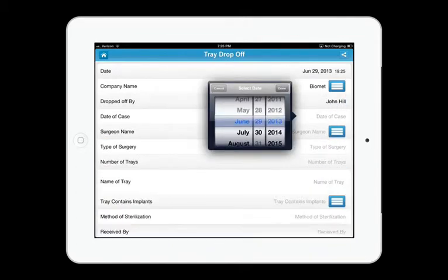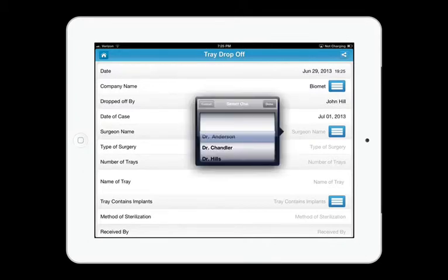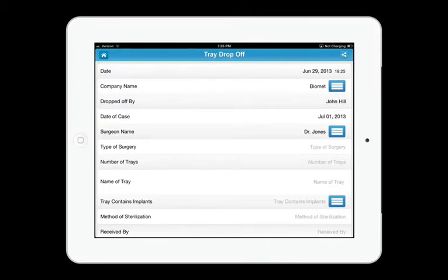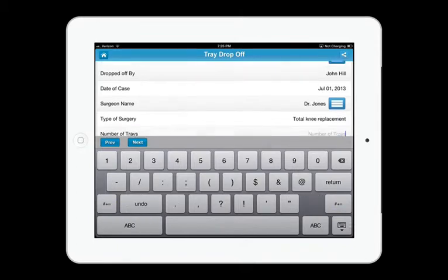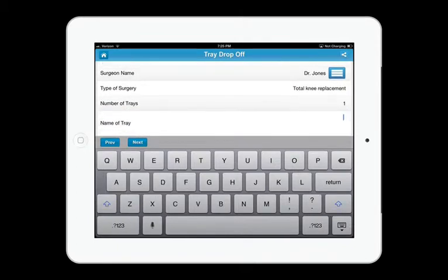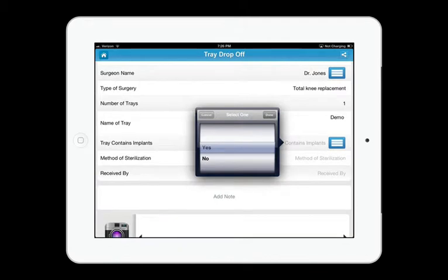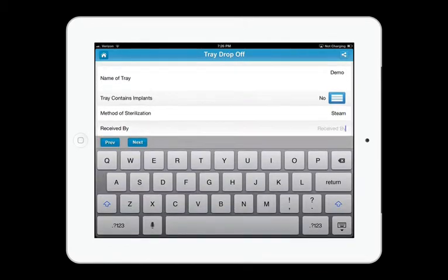Date of the case, surgeon name again from the custom picker, type of surgery, number of trays, name of tray. We'll just call this one demo. No implants, steam sterilization, received by Dave.